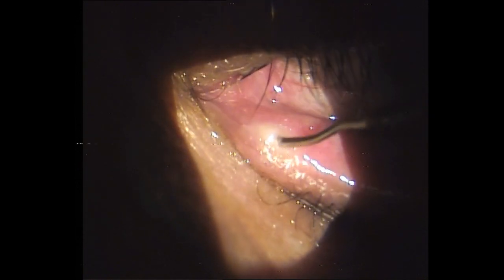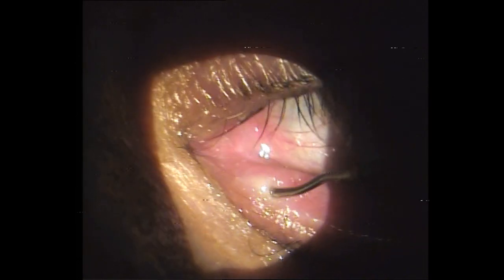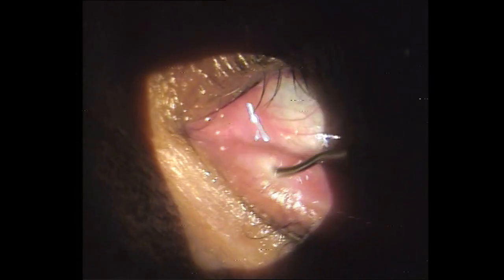So you tell the patient there's going to be salty water, which is taken from a normal saline infusion bottle, so it's pretty safe to swallow. Here you can see I went inside. Sometimes you just come back outside. So you go vertically inside, and then you go on horizontally. It is very important to go in line with this. Then you gently inject.